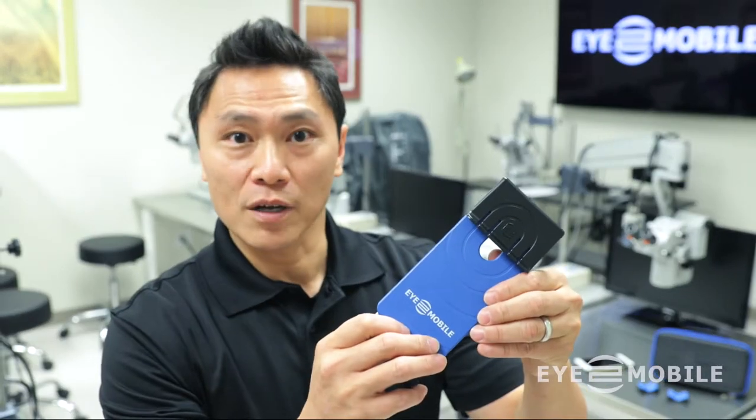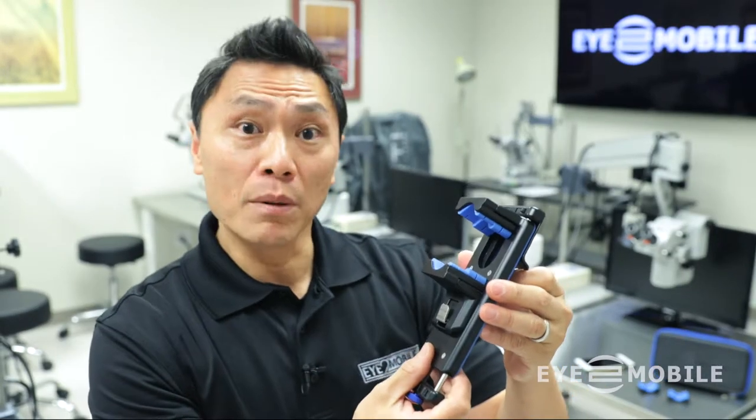Hi, I'm Jim Su, founder of iTWO Mobile. This is the PhoneDock, a mobile phone docking system designed to work with all microscopes.